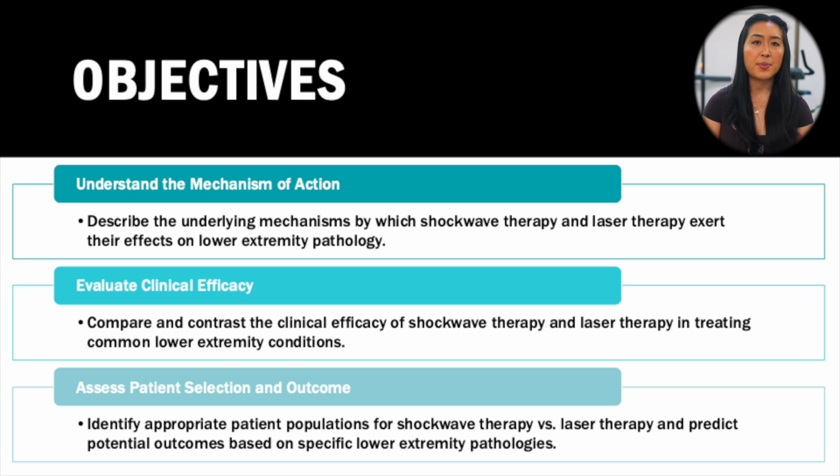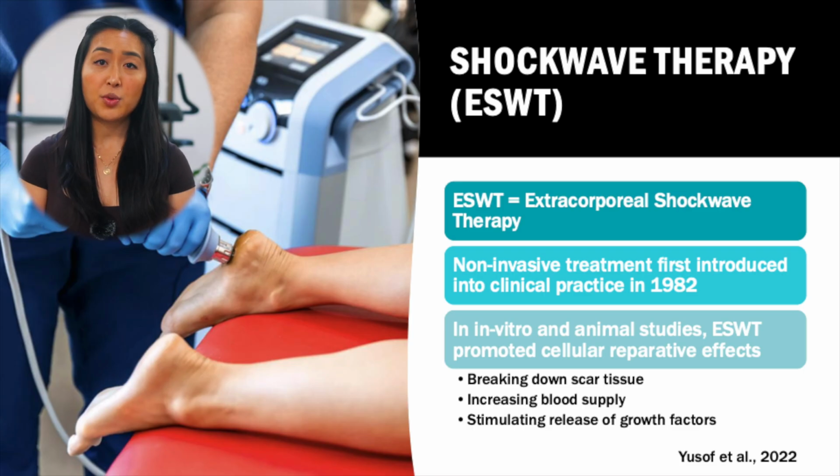We're also going to compare and contrast the clinical efficacy of these two treatment modalities for some common lower extremity conditions that we see clinically in physical therapy practice. This information will then help us to identify the appropriate patient populations to use these two modalities on to get us the best results based on today's most current literature. First, we will go over what shockwave therapy is.